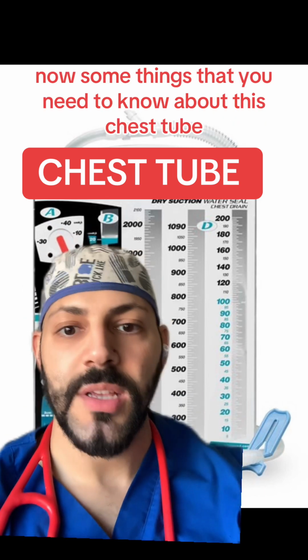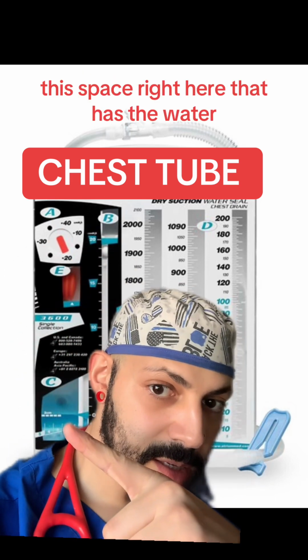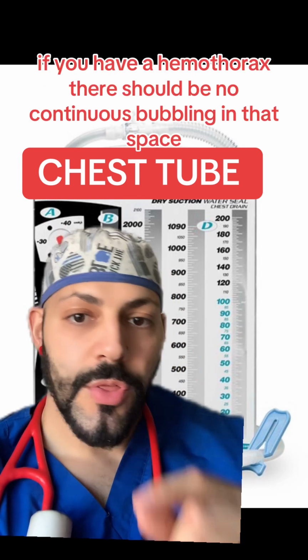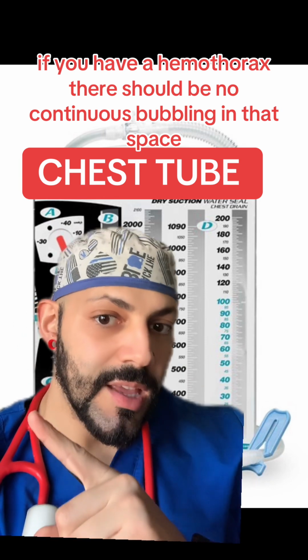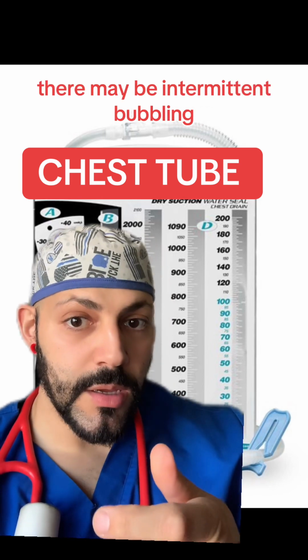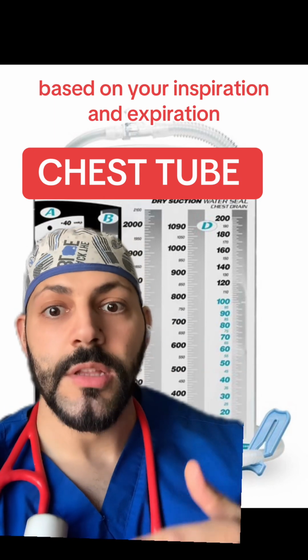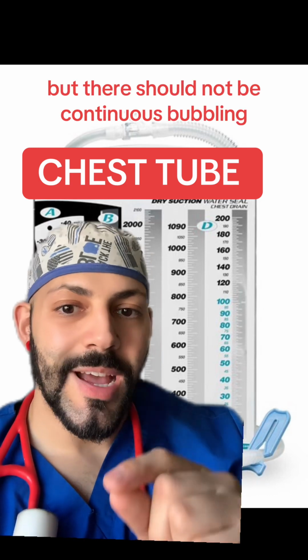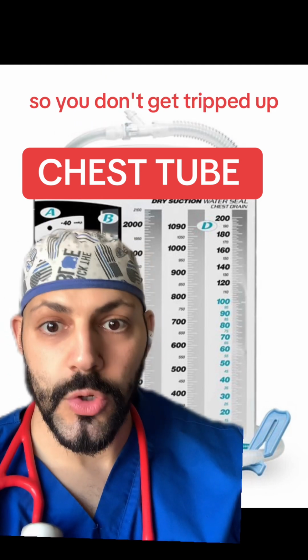All right. Now, some things that you need to know about this chest tube. This space right here that has the water, this is the water seal chamber. All right. If you have a hemothorax, there should be no continuous bubbling in that space. All right. There may be intermittent bubbling, which is okay. There may be rise and fall based on your inspiration and expiration. That's okay. That's all normal. But there should not be continuous bubbling. And this is where you have to read those questions very carefully so you don't get tripped up.